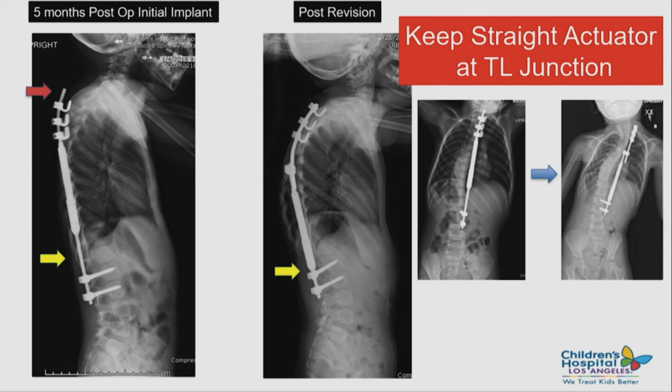David, we had a little project some years ago with finite element modeling where we looked at a new implant combining hook fixation with the pedicle hook. Have you tried that out or thought about it, of combining two traditional ways of fixation? Yeah, because as you say, we are very close to the transverse process. We are very close to the facet joint. So you could also combine it or even come from above. Have you? I think that's a good technique.